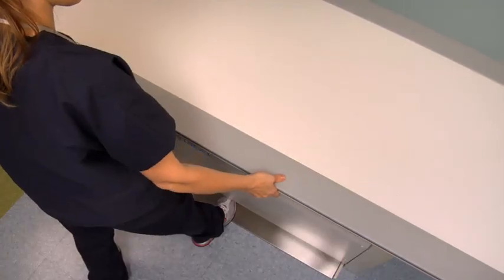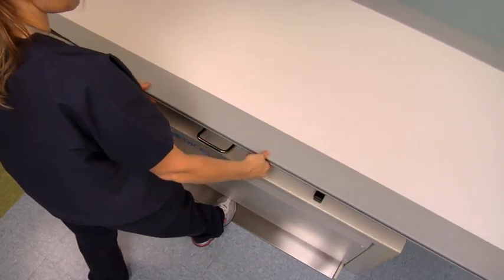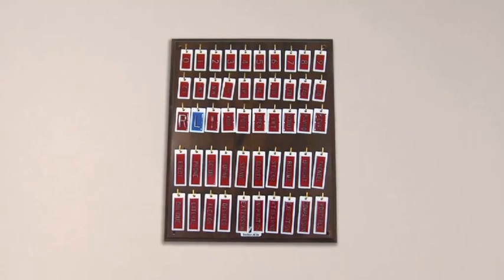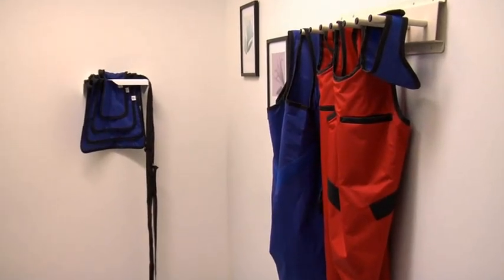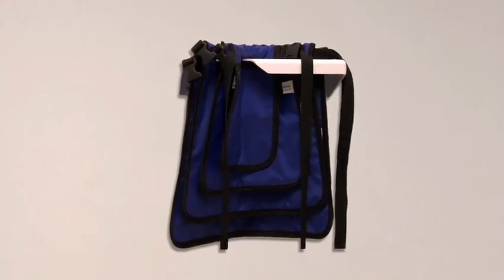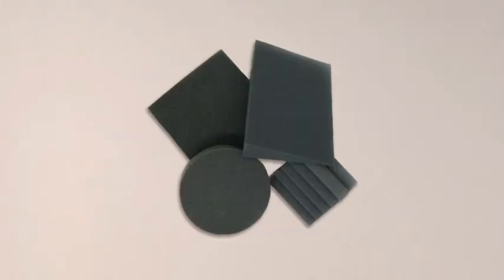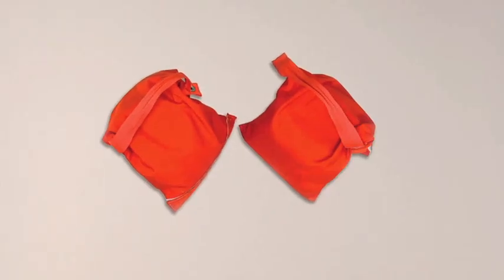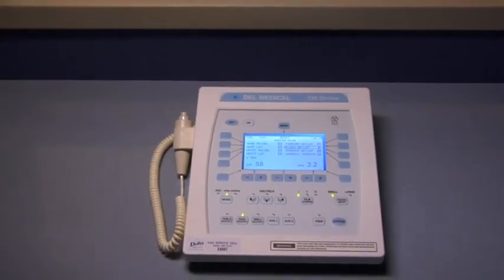a radiographic table with a floating top, which sometimes can be moved up and down. Movement of the table is controlled by a foot switch or bar, compensating filters of different types, lead or radio-opaque image markers, lead apron for caregivers or staff who need to remain in the room with the patient, patient radiation protection shields, lead blockers for multiple images on a single cassette, positioning aids such as radiolucent sponges and sandbags, anatomical position-enhancing aids such as weights, bed linen and towels, a control panel behind a lead-lined screen.